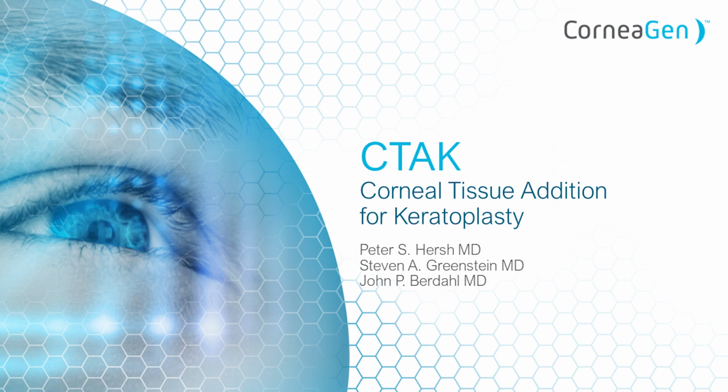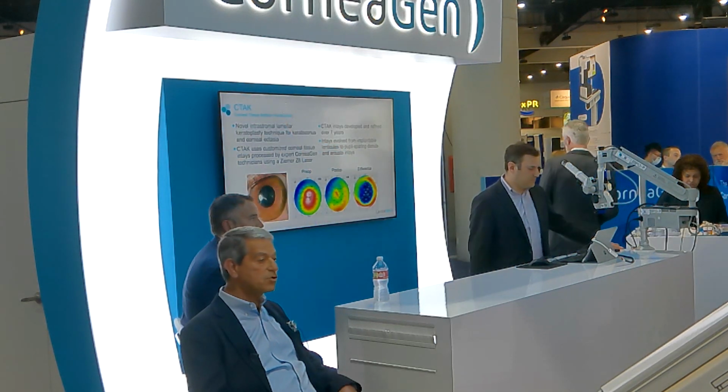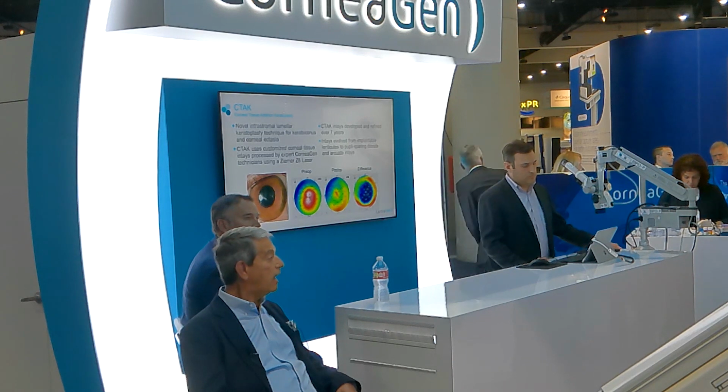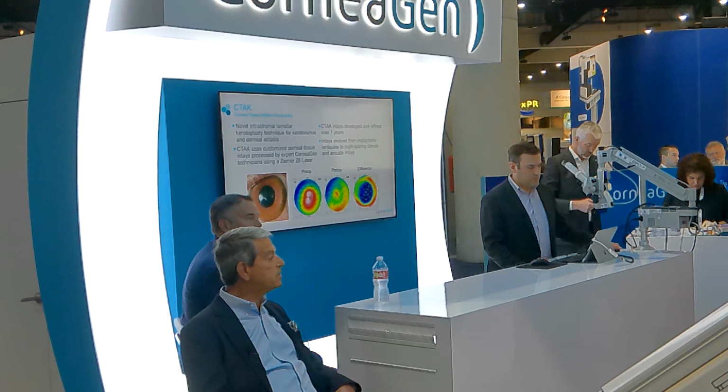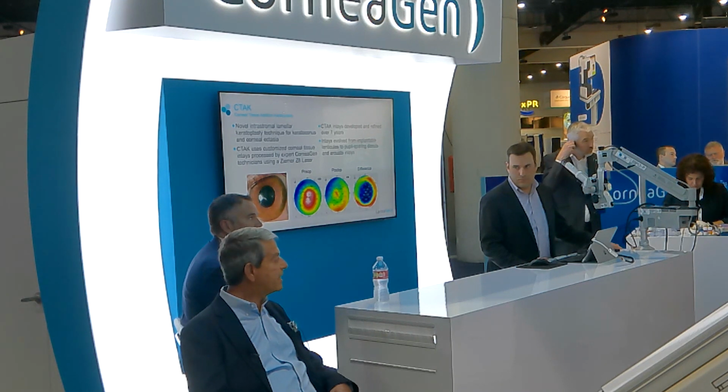What we want to do today is introduce you to something new that we at CorneaGen have been developing over the past 7 years, which we're really excited about for the treatment of keratoconus. We call it CTAK, or corneal tissue addition keratoplasty, for keratoconus and corneal ectasia. It's been something that we've been working on and evolving over the past 7 years.